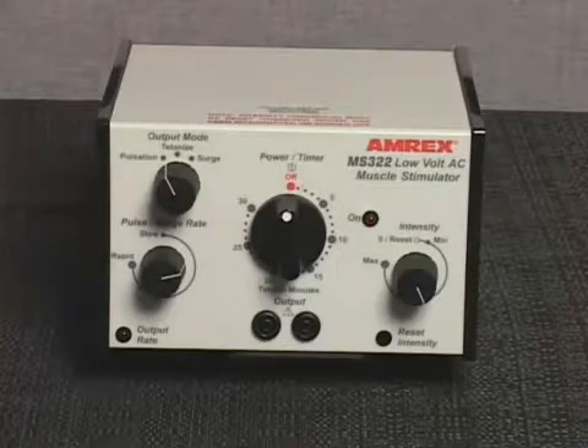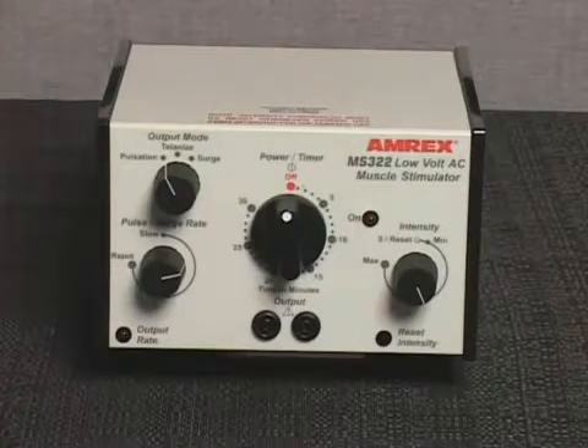To continue or extend the treatment duration, reset the power timer knob within 10 seconds of shutoff. To prematurely end the treatment, rotate the power timer knob counterclockwise to the off position. The AC power will shut off and a bell will sound.